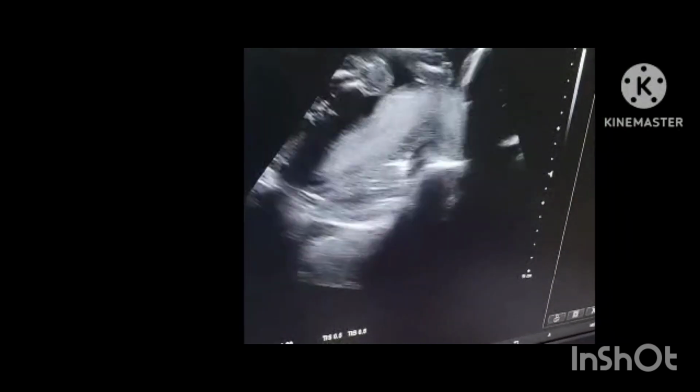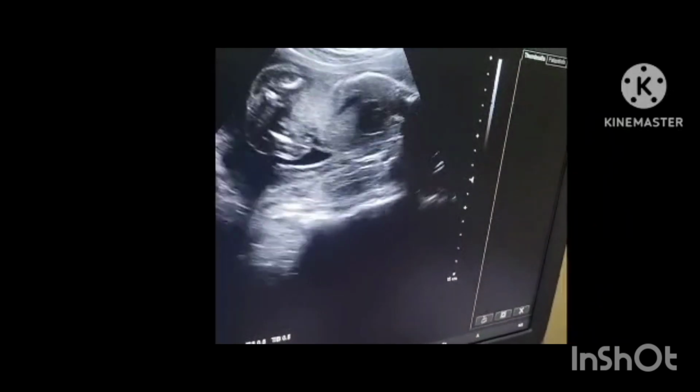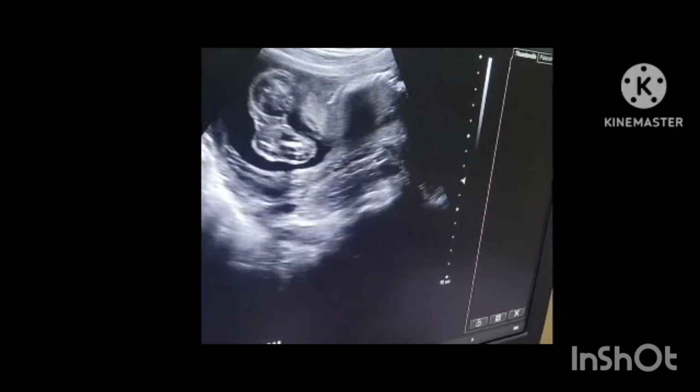Thorough scan of the fetus is normal. No abnormality of the head, abdomen, spine, limbs, amniotic fluid and cardiac chambers is seen. Fetal parameters are very much within normal range with regard to this gestational age. A scan from uterus to adnexa reveals a normal adnexa.